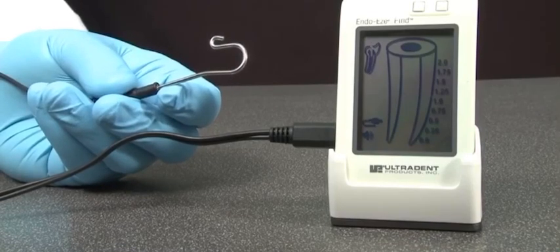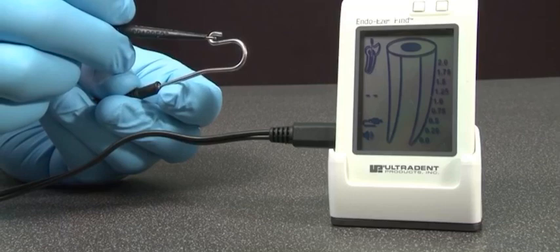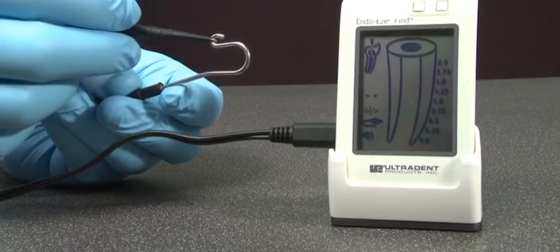Plug the file clip and the lip clip into the measuring cable, then touch the metal portion of the file clip to the lip clip. The connection icon should appear, demonstrating the electronic circuit is operating properly.